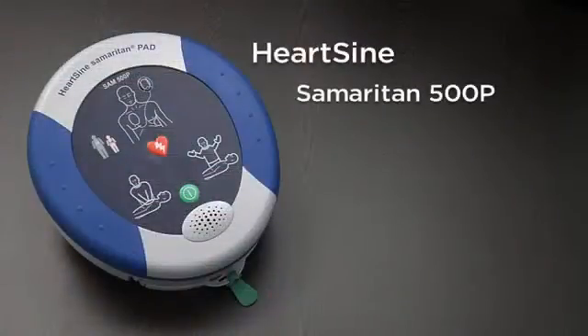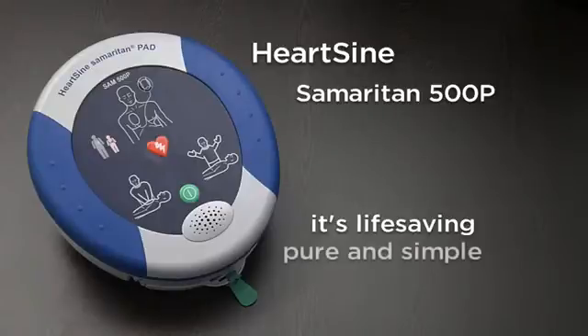The Samaritan 500P — more than an AED. It's life saving, pure and simple.